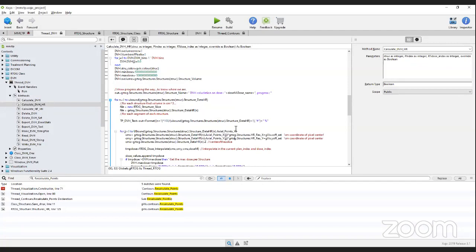Yeah, and the reason why I say you can go smaller than that is it really depends on your application. And for our application, we're looking at microbeam radiation therapy. So our dose calculation is actually finer than our CT resolution. And it's kind of a unique situation, but the only way to see that level of detail is to look at smaller voxels.